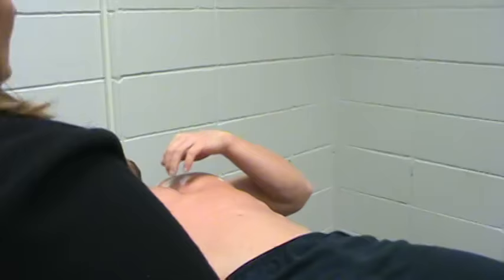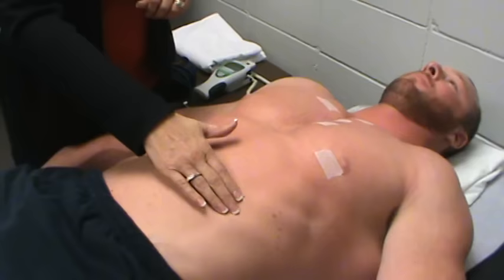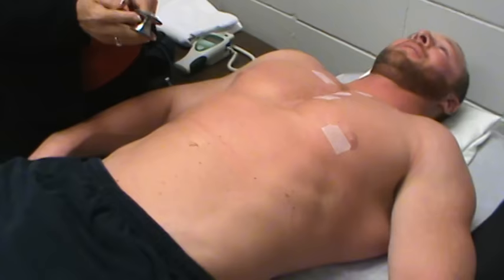I'm going to divide your abdomen into four quadrants, actually, okay, using your umbilicus as a reference point. So we're going to have four quadrants. This up here is going to be your right upper quadrant, your left upper quadrant, your left lower quadrant, and your right lower quadrant. Okay? And I'm just going to listen. I keep forgetting to turn my stethoscope back. All right.